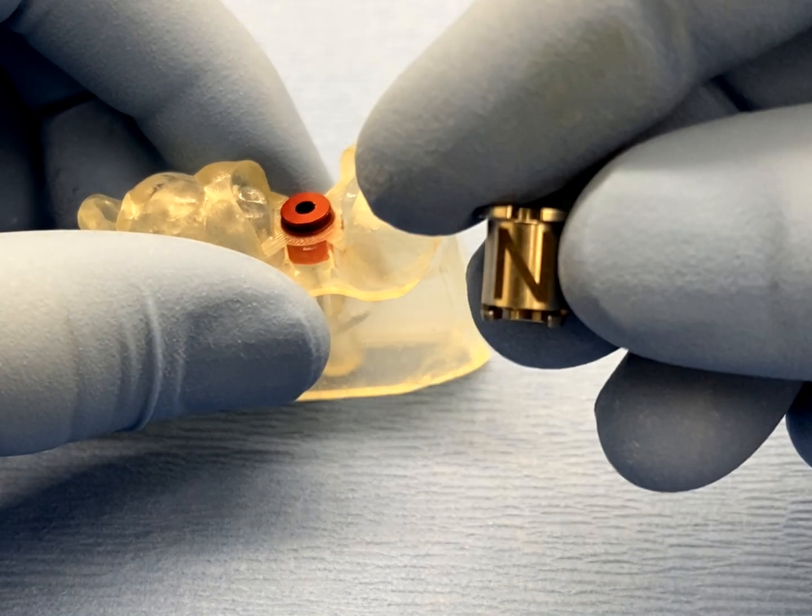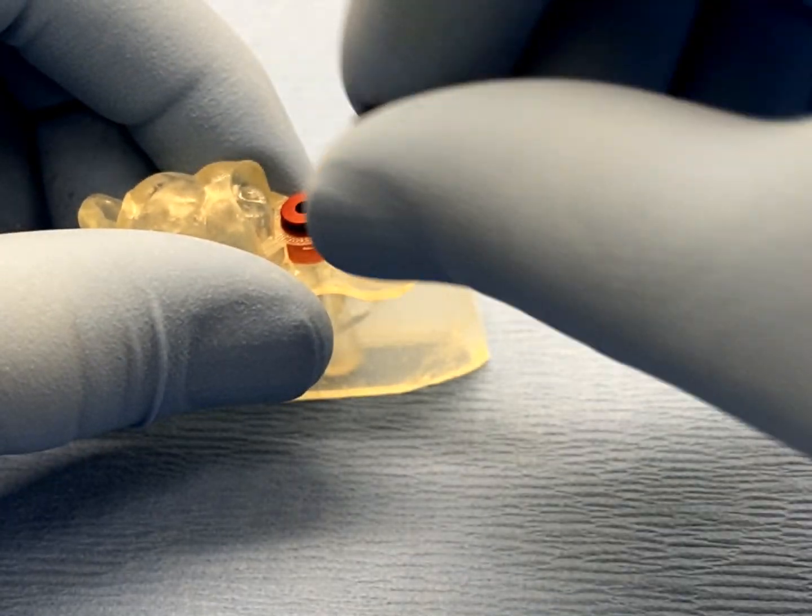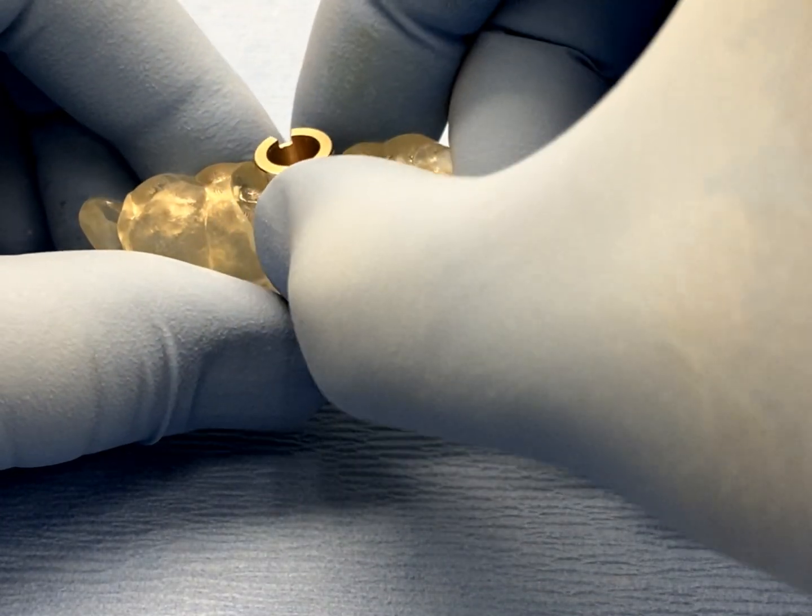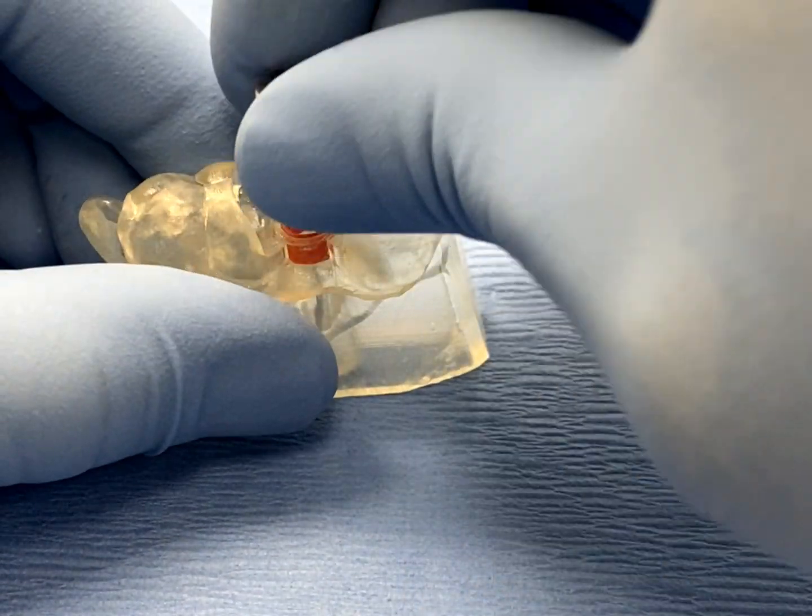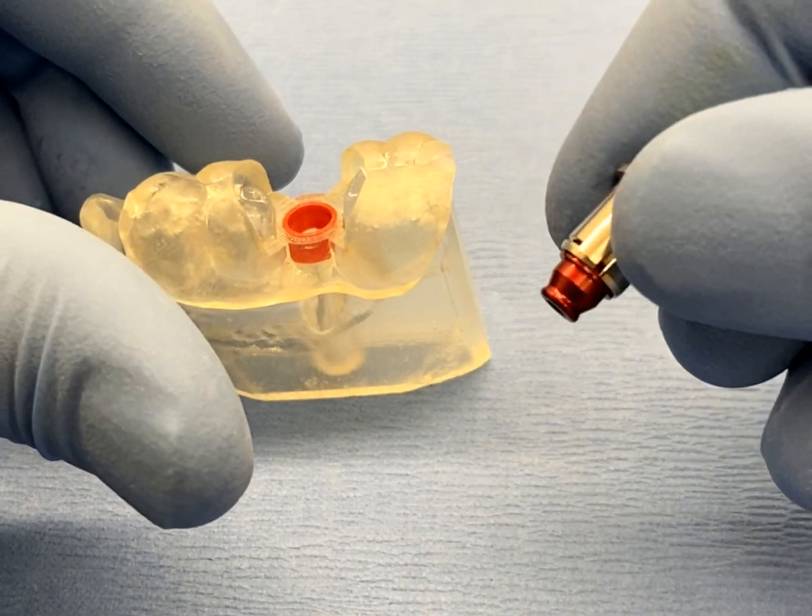Once the curing process has been completed, simply remove the surgical guide analog from the newly formed surgical guide with a GRS IR tool.